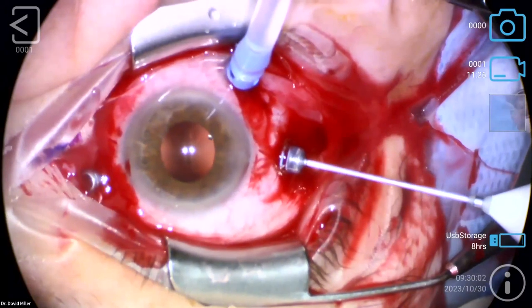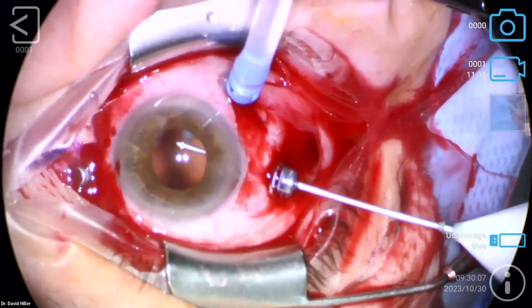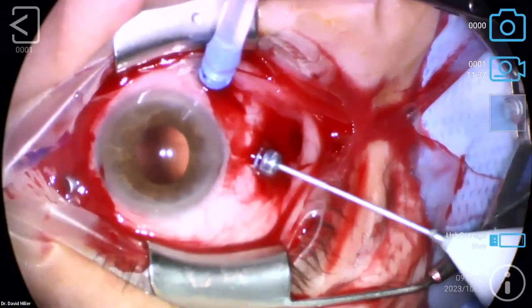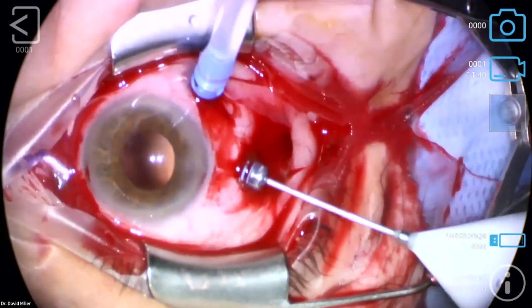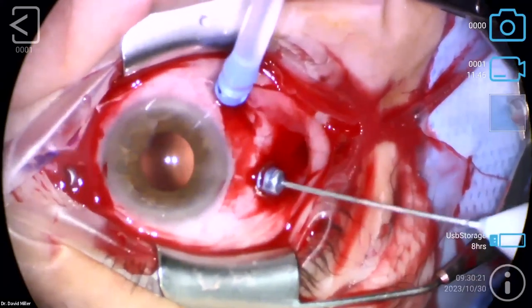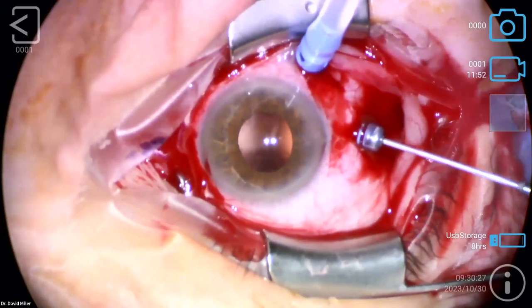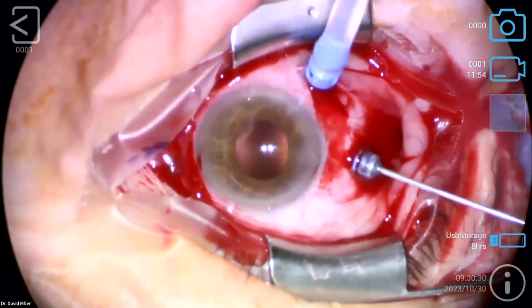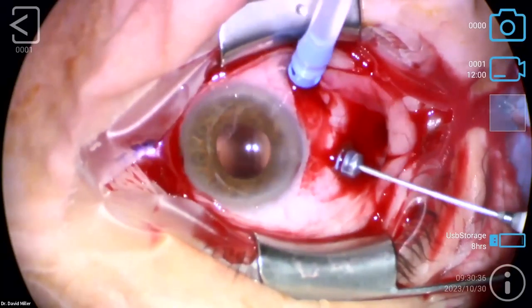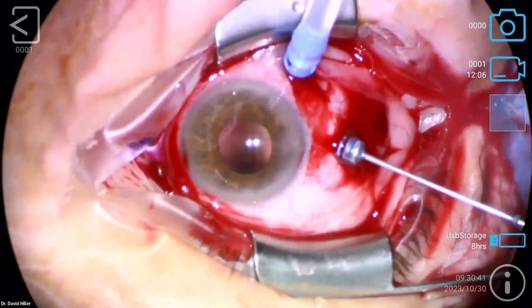You got another Q-tip there for me? What you want to be careful of here is making sure you have, maybe we can get it on aspiration, our vacuum. So we're going to change the settings on the machine to pull a little stronger. What you're going to do when you grab the iris like that is stop and make sure you don't have the cutter on. You don't want to make extra PIs.